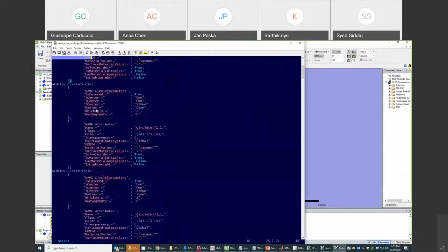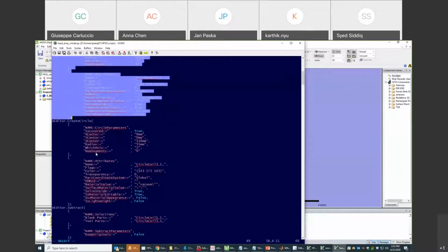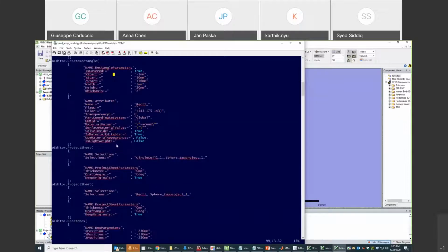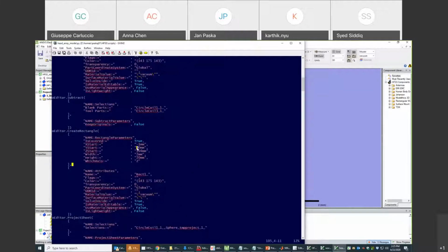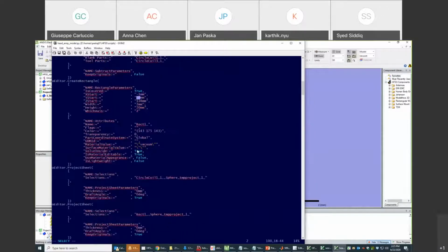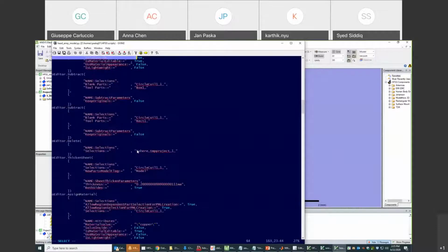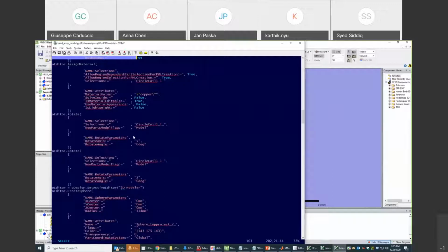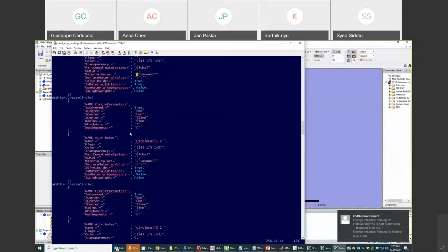Here are some circles created, another circle is created, then you subtract the circle. So I create a coil that way. It's a little bit intuitive, so you can actually go and edit those numbers here with a different program. You can do it with Python itself if you know it already, or if you want to learn it, that's probably a good thing. But I'm doing it in MATLAB, and it works for me.